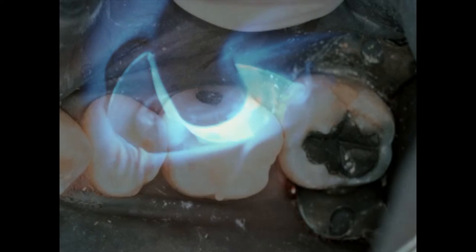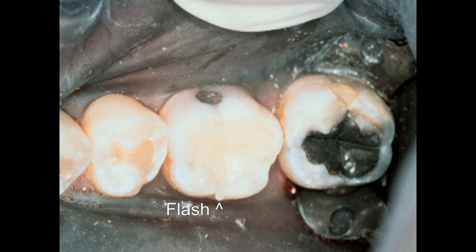We remove the old amalgam, put in bonding resin, put in our composite, and force the clear custom matrix into the unset composite. Then we place the flat end of the light-curing bundle on the flat surface created by the mylar strip, apply pressure, and cure the composite through the clear custom matrix.